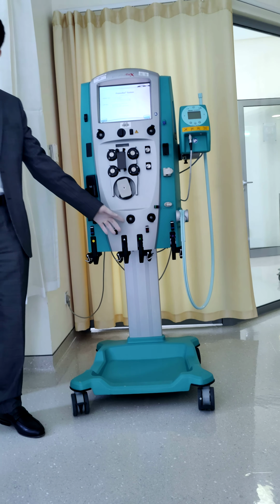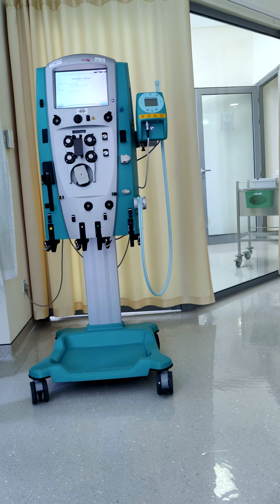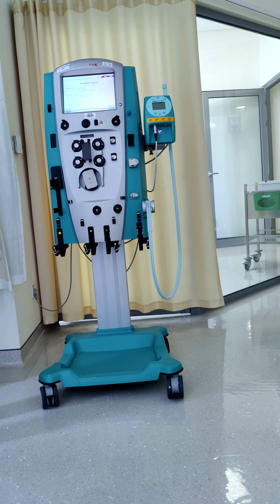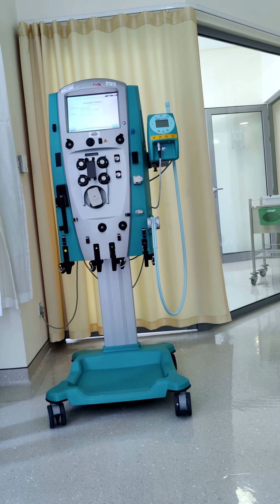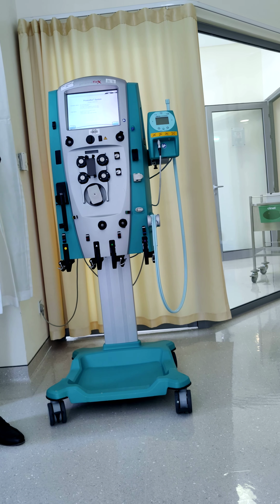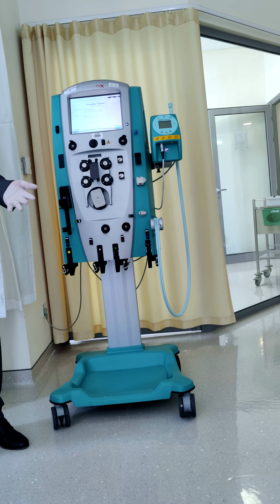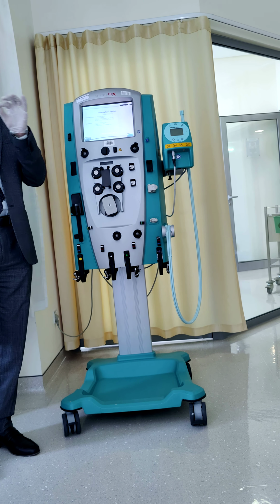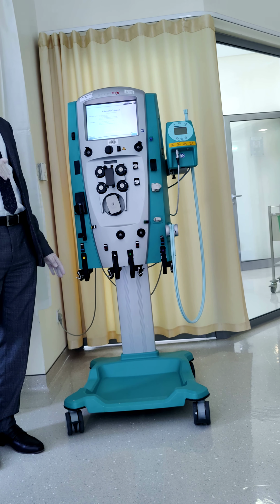Usually we are not using pre-blood pump, it will be 0 only. If you are using it, you can use a minimum amount, like 50 or 100 ml, and you have to include it in your concentration calculation, and you know it will stay in the patient's body. If the patient has hypotension or something, you can give him 300 ml saline or solution, it's okay. You can give 100 ml per hour for 3 hours, it means 300. But keep in mind, it will not come back. It will be retained in the patient.